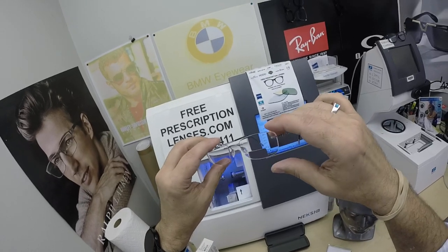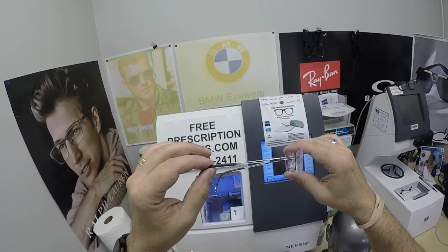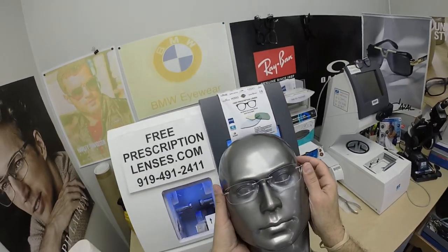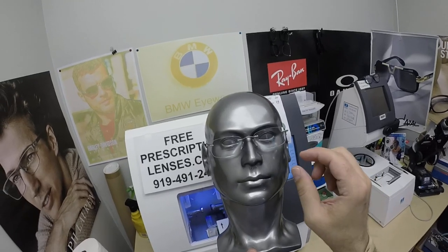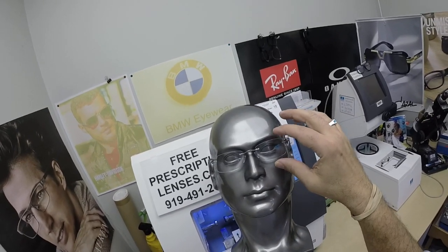There's nothing lighter, there's nothing stronger. These are 1.5 grams — the lightest weight pair of glasses out there. And he got them with the classic traditional line-style bifocal. Being independent, I can do any type of lens. He got shape EW in the 52 eye size.